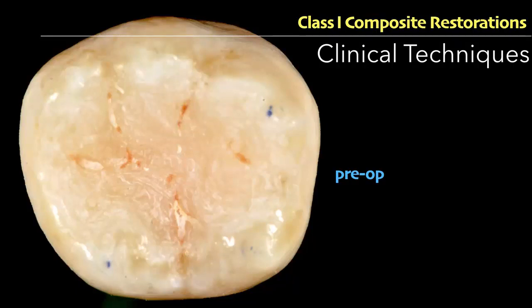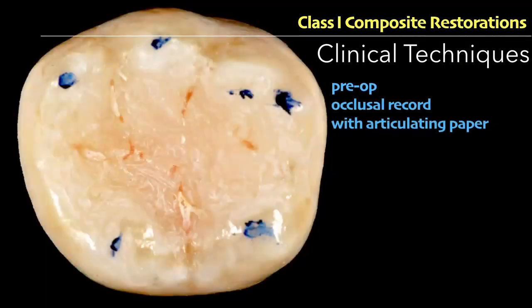So we need to restore that tooth as natural as possible, so that the patient can masticate as we do with our natural dentition. Guys, as you know, before the start of the procedure, we need to record the occlusion, as the patient's occlusion has been changed by a previous dentist. So it might be difficult to maintain the natural occlusion in such cases.